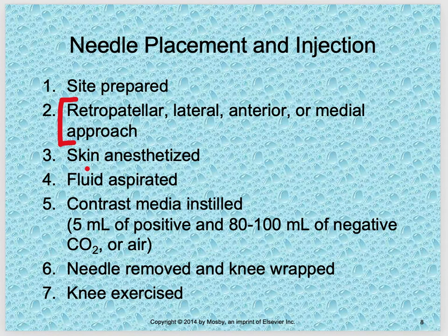And then skin anesthetized. Sometimes they have an ointment that they can rub on so it deadens the skin so it doesn't hurt when the needle goes in. But once again, that all depends. Fluid aspirated, if you're going to remove any fluid, going to collect any of that fluid to send to the lab. And that would all be within the orders or within the scope of the protocol.